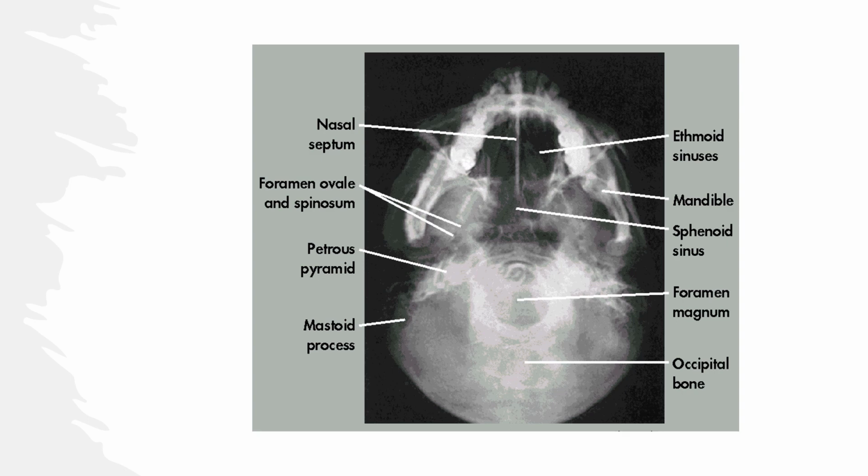So because when we get to the TMJ joints, or not the TMJ joints, the zygomatic arches are oblique variants of the SMV projection. So if you see one of the zygomatic arches flaring out, but the other one is kind of tucked behind the mandible, and the mandible is asymmetric to the mid-sagittal plane, well, then you've obliqued the patient. Congratulations, you've done a zygomatic arch projection. Unfortunately, you're trying to do a perfectly symmetric SMV projection. Okay.